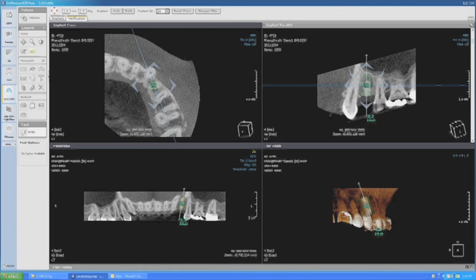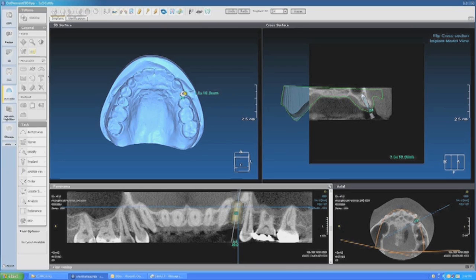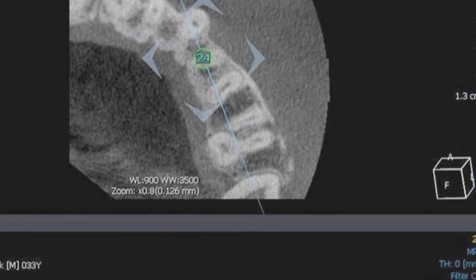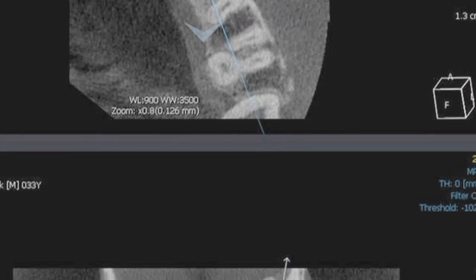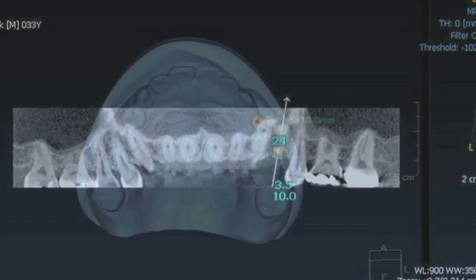As a general dentist who has placed nearly 7,000 dental implants, I have come to understand the importance of planning from day one for both the implant placement and soft tissue healing that will best help me achieve the prosthetic goals for my patients. Being able to visualize the finished case prior to ever starting is even more relevant today.